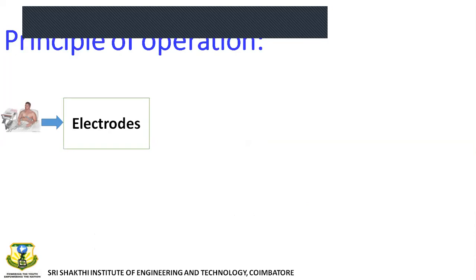So from these electrodes, as usual, we give it to an amplifier. The amplifiers can be of two types: pre-amplifiers and post-amplifiers. Pre-amplifiers are next to the electrodes. Post-amplifiers will basically be power amplifiers, right? To boost the signal to a higher extent.